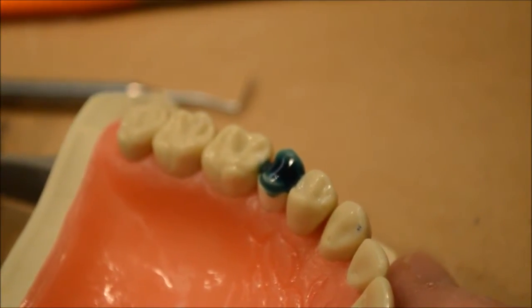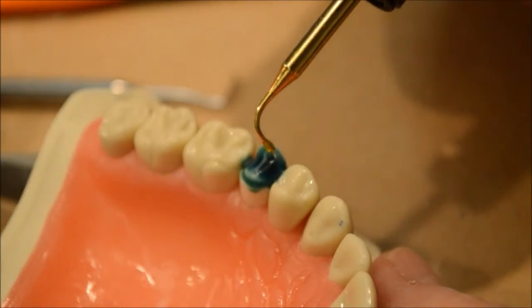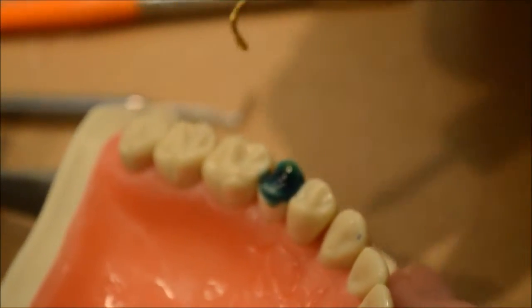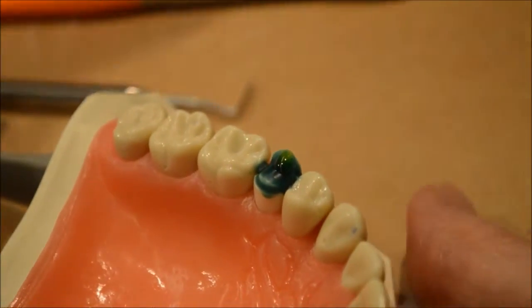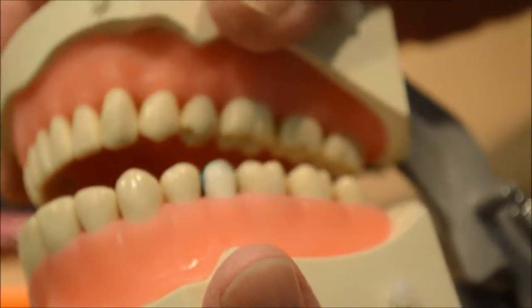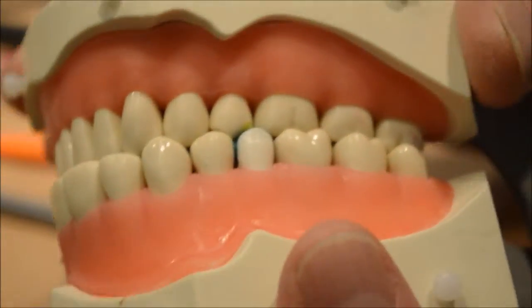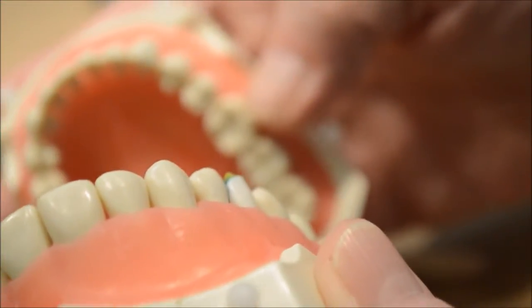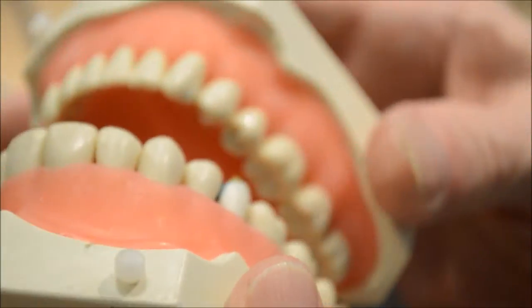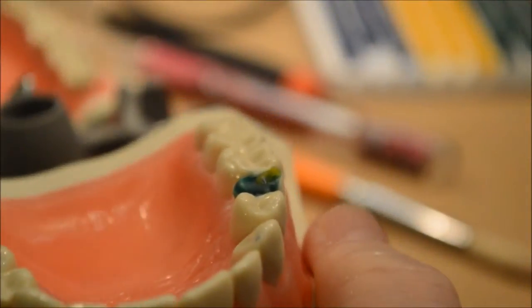Next we're going to put our cone tips in — they're in yellow. The cone tips go right there, and we have to make sure that when we close down the articulator, that yellow goes right between the embrasures of the lower second premolar and the lower first molar on the right side. So we go into what we call a lateral excursion to see if that point goes through there — it's not quite right just yet, so I have to fix it a little bit more.